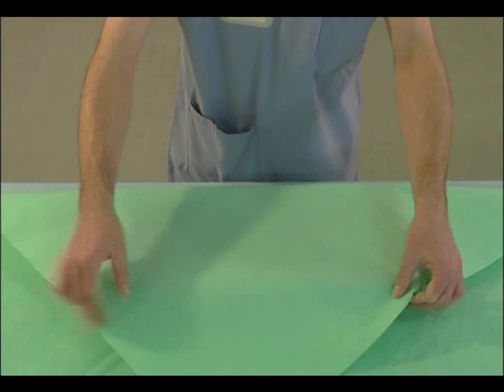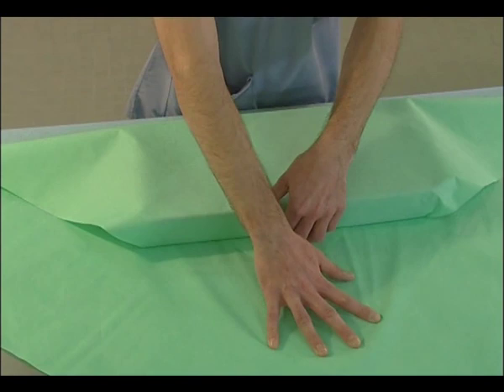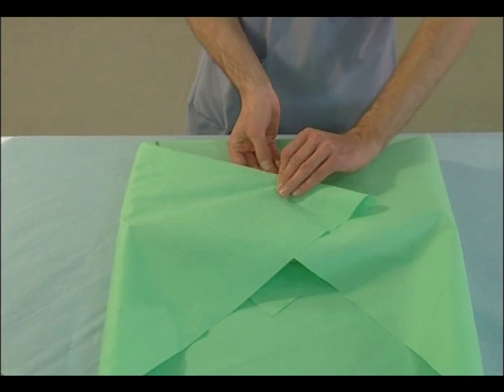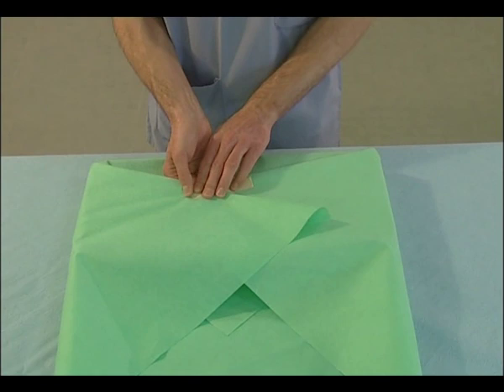Envelope folding is the most common. This is the recommended fold because it creates a more tortuous path, more double bends, which means a better barrier against penetration of microorganisms. The use of two sheets is essential to provide additional safety. It strengthens the solidity of the pack and the guarantees of sterility maintenance.